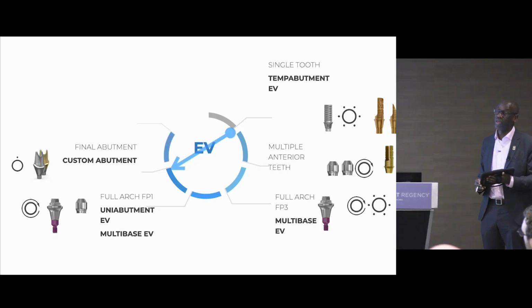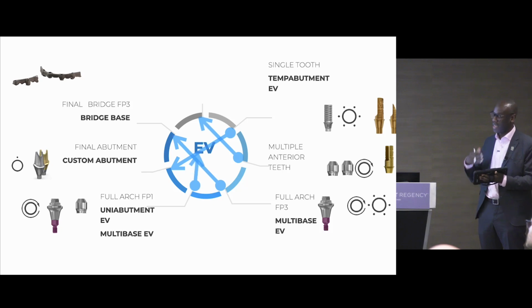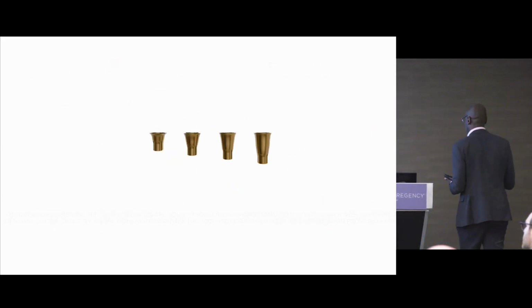And as well as that, within the Elos system, Steve is going to touch a little bit upon their customization and how it is possible. So you can make custom abutments within that. So it allows us to address all of these issues within this implant system by using the Elos components, should we choose to. So first thing, let's talk about what the key part here is.